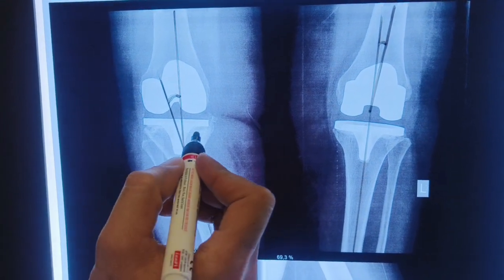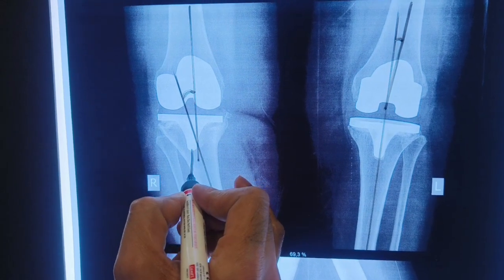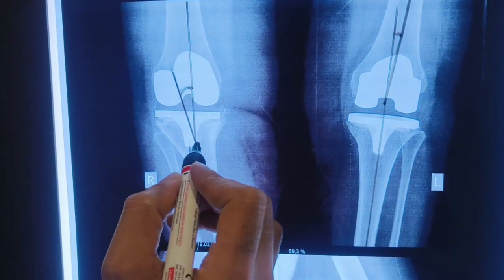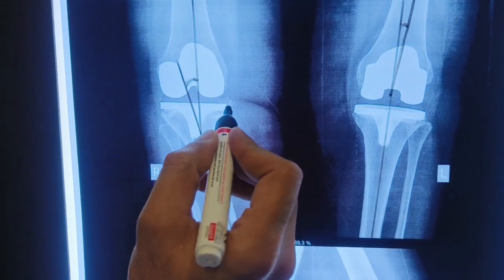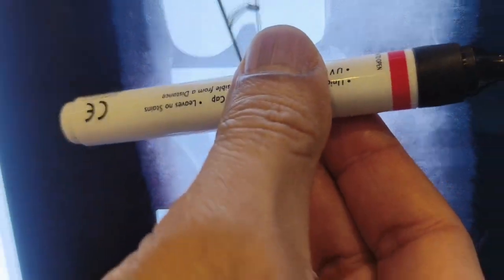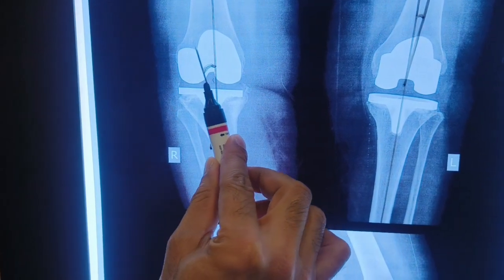What happened? The tibial implant is loose. If you look at this, the tibial implant is here — the tibial implant is in the center. The reason is that the bone on the medial side is absorbed and removed. The implant is lifted, so the tibia lifts here. The tibial implant is tilted, and the leg deformity is on the right side.